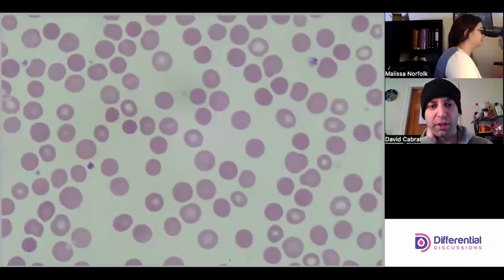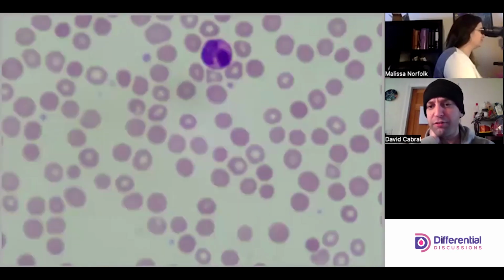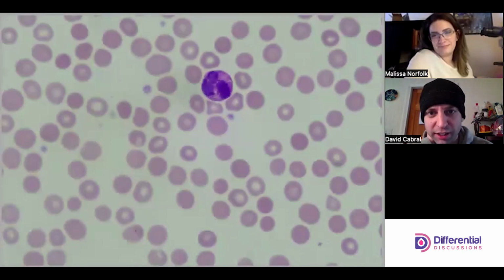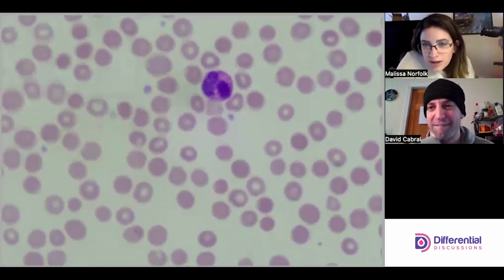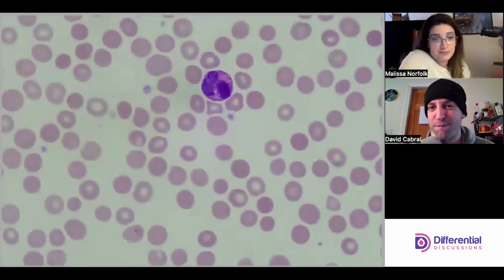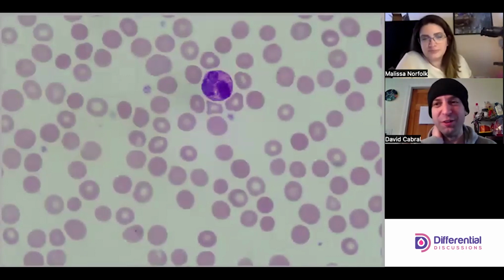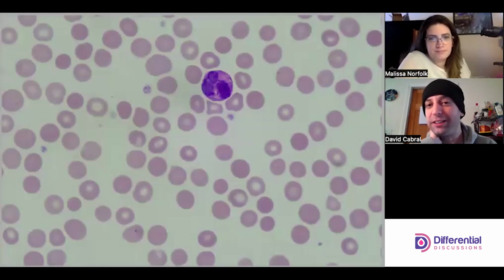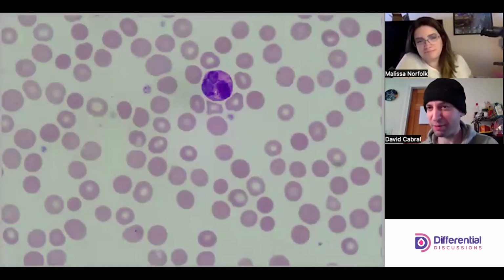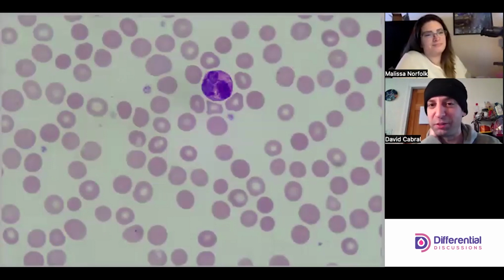As you scroll around, I'll note that there appears to be some echinocytosis. This individual may be getting blood transfusions. Is that a baso? It's a baso. I saw it when I was cruising by and wanted to stop, because this is not toxic granulation. Absolutely. The color of the cytoplasm is just different from a neutrophil, really subtle. It has to do with the soluble contents of the granules. This baso maybe doesn't have as many granules as other basos you've seen, and part of the color of the cytoplasm is that they've dissolved and bled into the cytoplasm a little bit. Really cool.